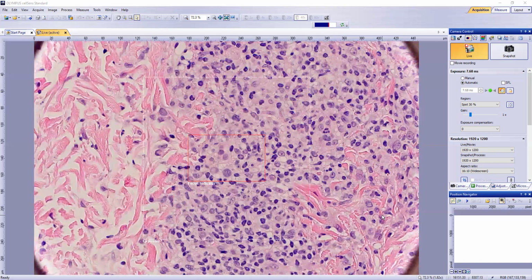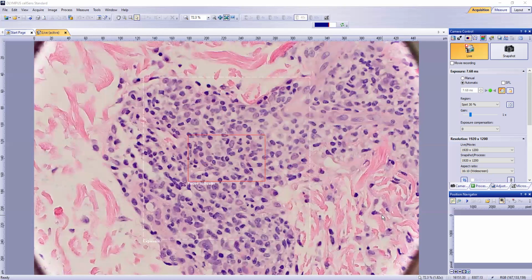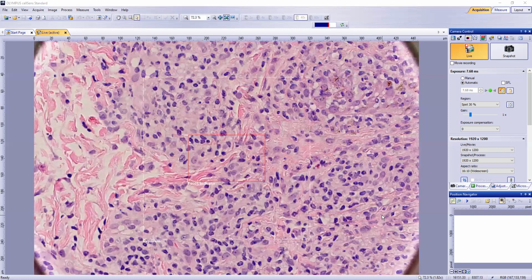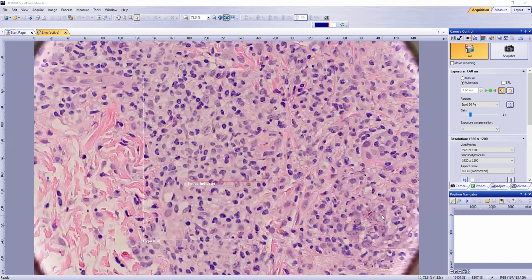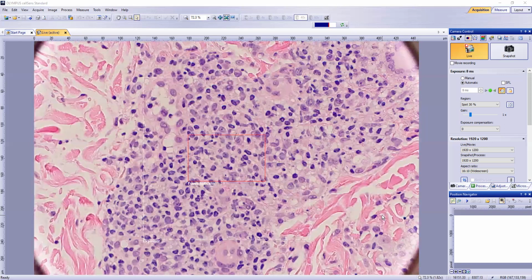And here are some more plasma cells. That's a plasma cell there. See if we can find a few more plasma cells. But plasma cells tend to be a feature that's closely linked with syphilis, and often is a trigger for us to get a treponema pallidum stain in cases where we are suspicious for syphilis, secondary syphilis. It's another plasma cell there.